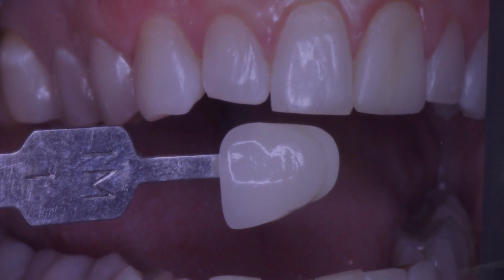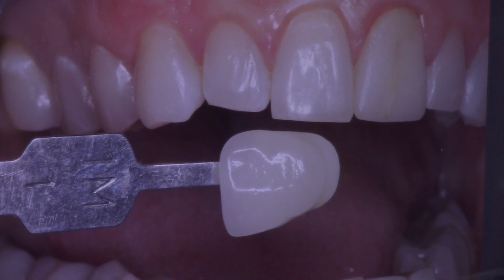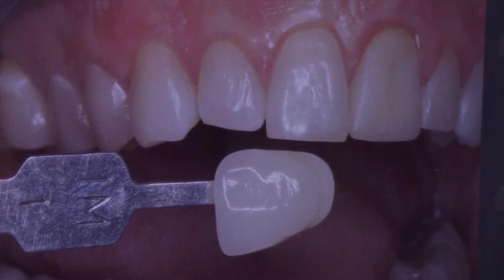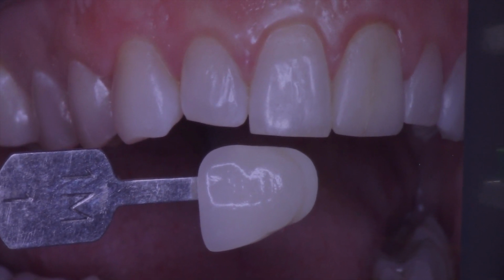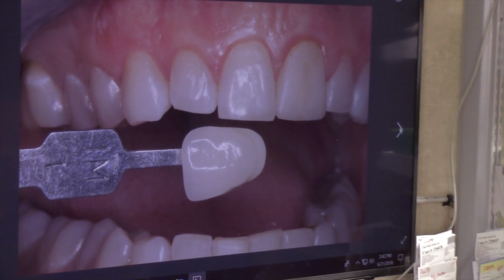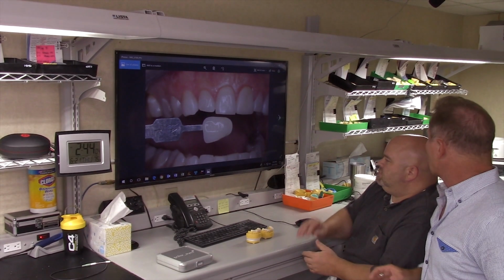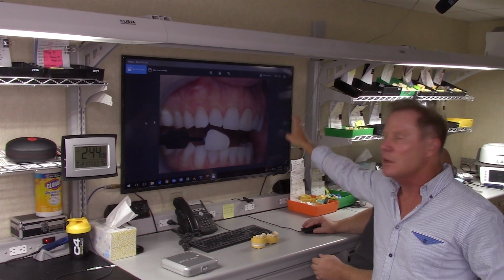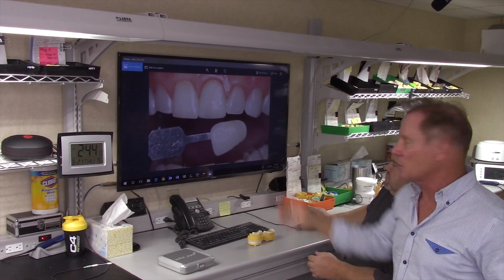It's very important when you have a tooth with multiple shades to take photos with the shade tabs as close to the same two-dimensional plane as the teeth you're trying to match versus on top of the tooth or too far behind it. Use as many shade tabs as you can that pull in shades from that tooth. Because you can see, keep going there a little bit, Phil, you can see we have different shades, so he can see the relationship between the shade tab and the teeth we're going to match.